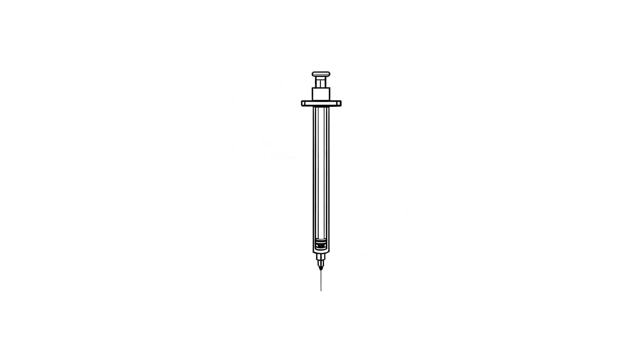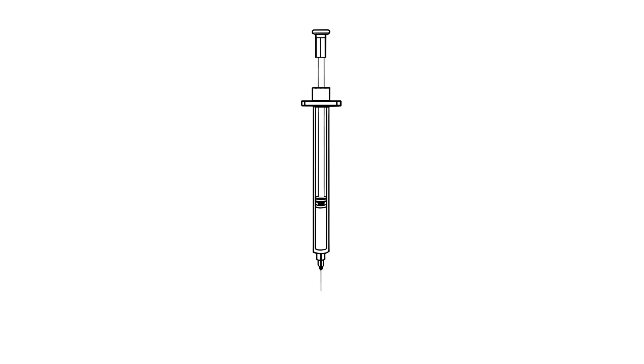Draw air into the syringe using the same number of units as the dose of insulin. For example, if your child's dose is two units, draw up two units of air.